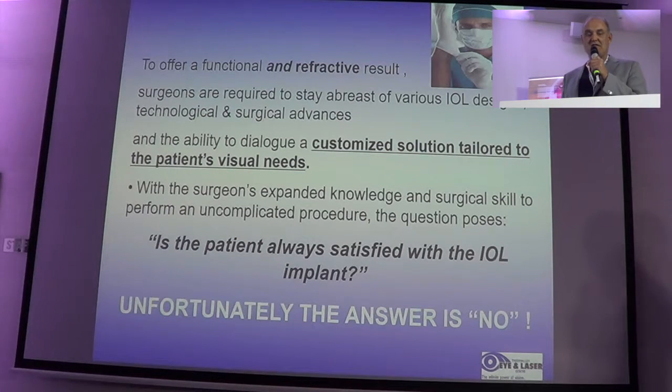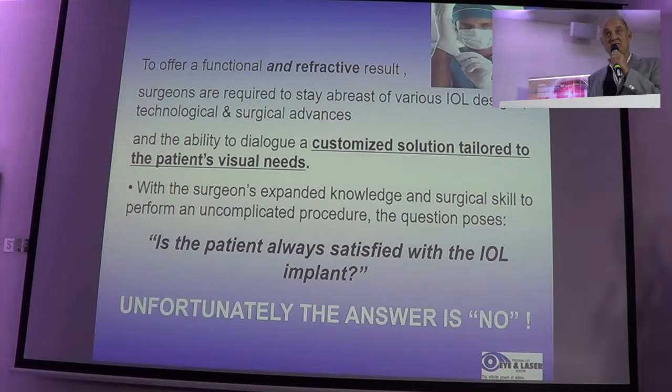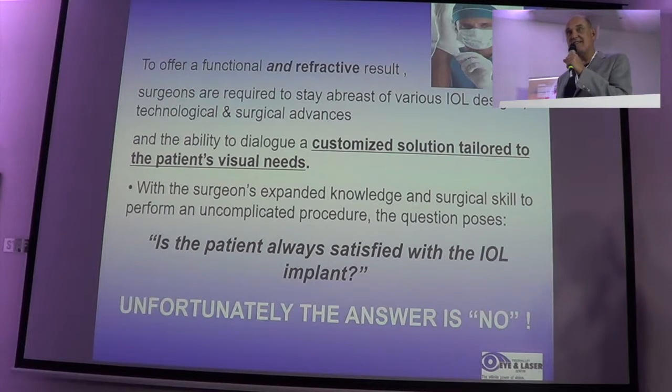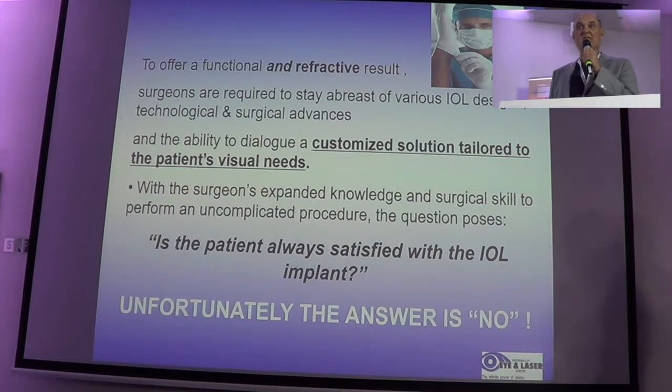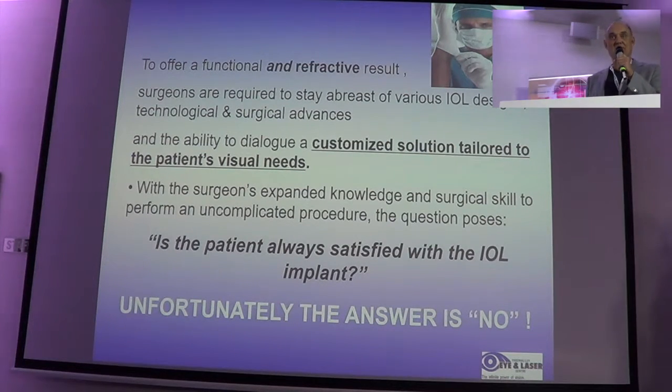To offer a functional and refractive result, surgeons are required to also be aware of all the new technologies and how they function, to actually select a proper customized solution tailored to the patient's needs. If you listen carefully to what Klaus was saying, you really have to listen to what the patient wants. You may think that you've selected the right lens, and the problem is there's always going to be somebody that's unfortunately not happy.